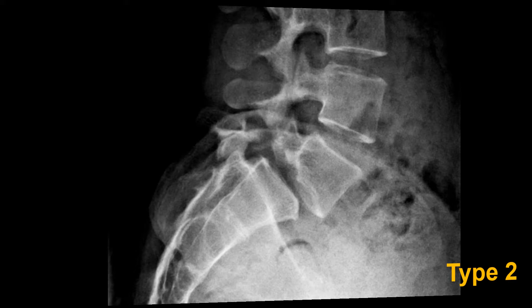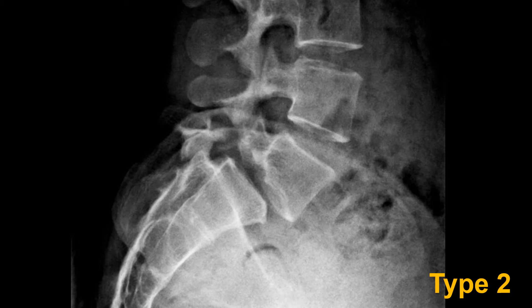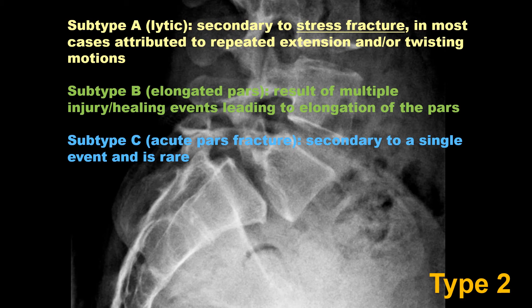Here is an example of a type 2 isthmic spondylolisthesis with a pars defect: anterior translation of L5 in relation to the sacrum, trapezoidal L5 vertebral body shape, loss of L5-S1 intervertebral disc height, and the spinous process is where it should be while L5 has moved forward. These are all classic findings of this type of spondylolisthesis.